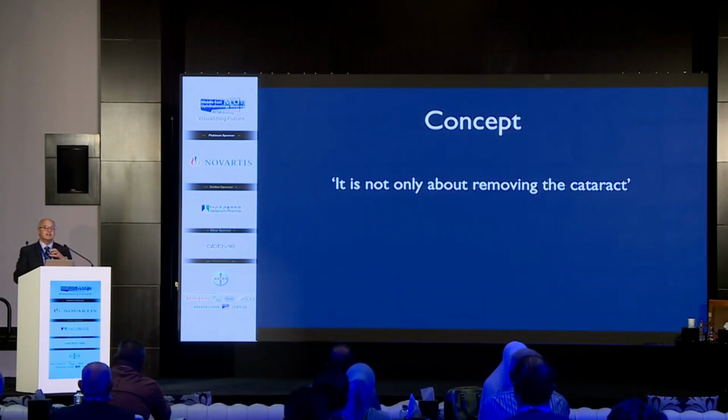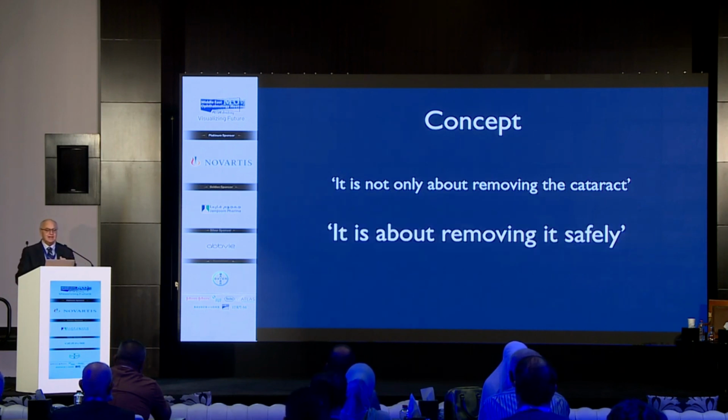The concept is not about removing the cataract. It is about removing it safely, because sometimes people think when they are doing, or you see juniors working with a hard or a regular cataract, you will always hear ultrasound. If you're using too much ultrasound in the wrong place, which is near the cornea, you will get problems.